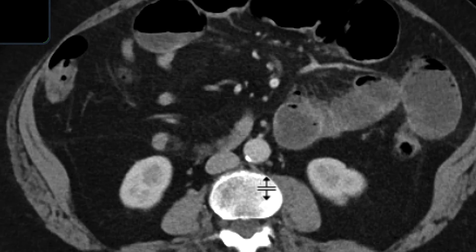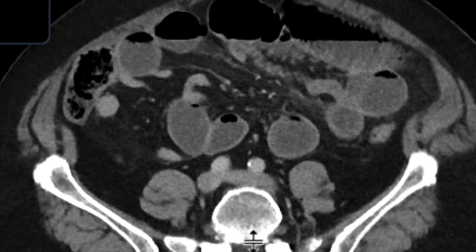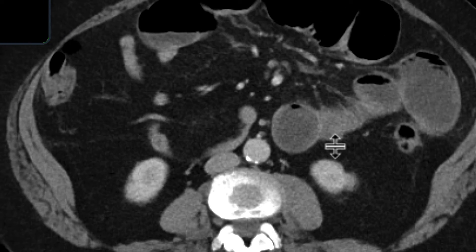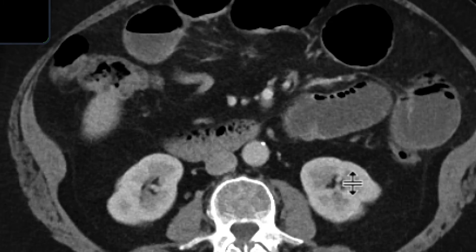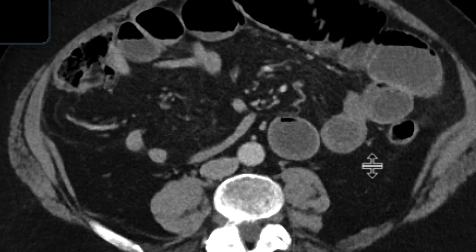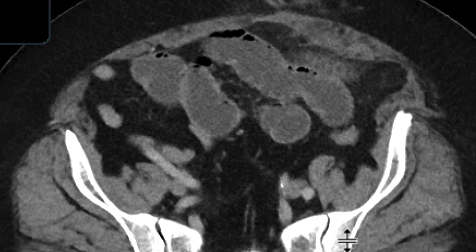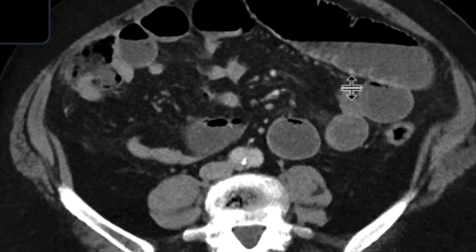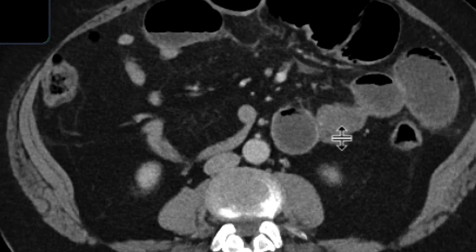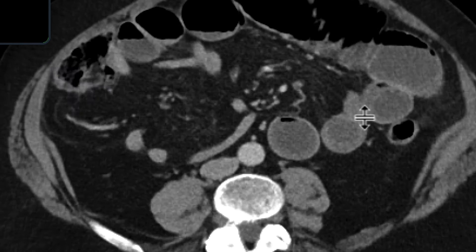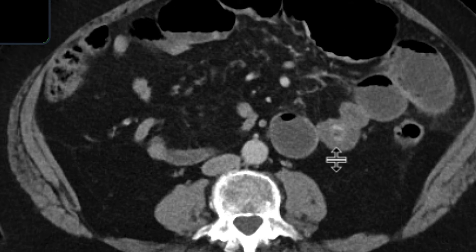As we scroll down further, we can see the region of transition. Upstream from here, there is a loop of bowel that's mildly distended and contains a partially calcified structure. All the bowel loops upstream from that are distended, while all the loops distal to that partially calcified structure are underdistended. So that's the area of transition, and right in that region we're seeing a partially calcified structure.